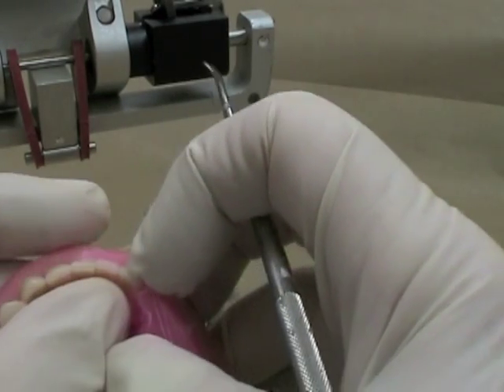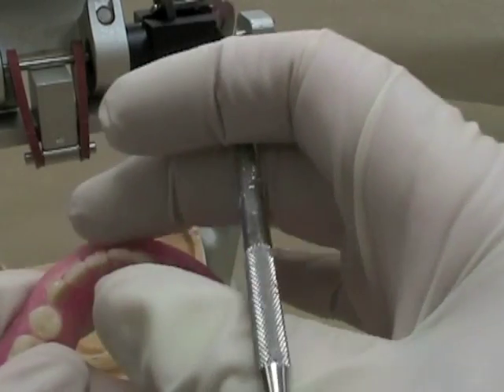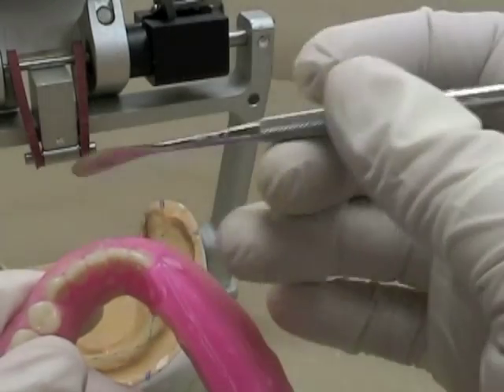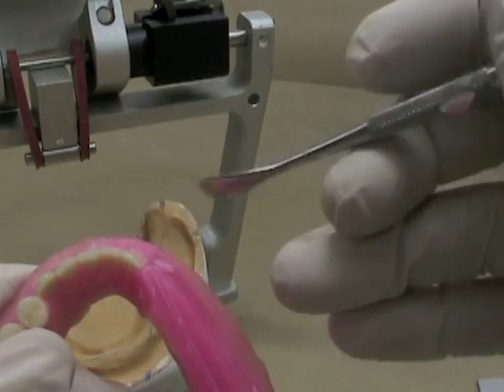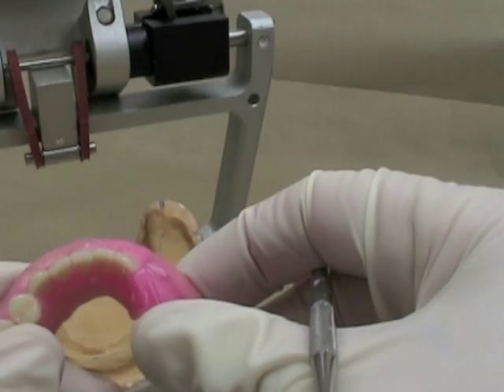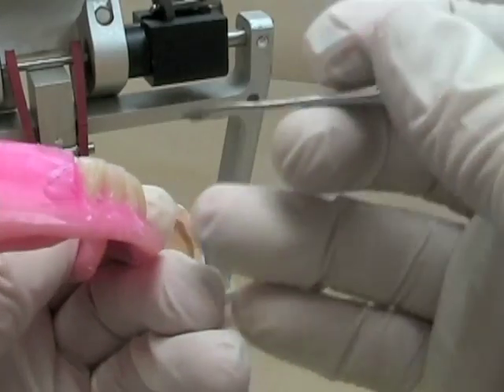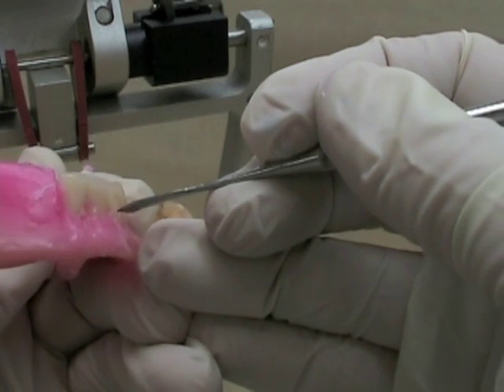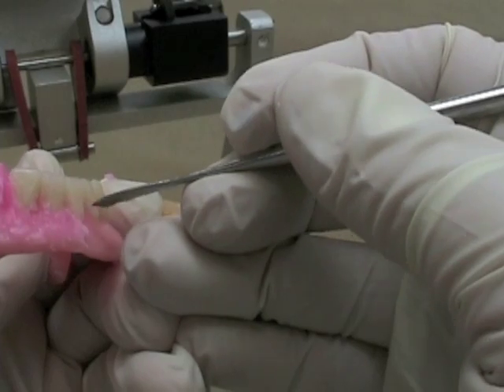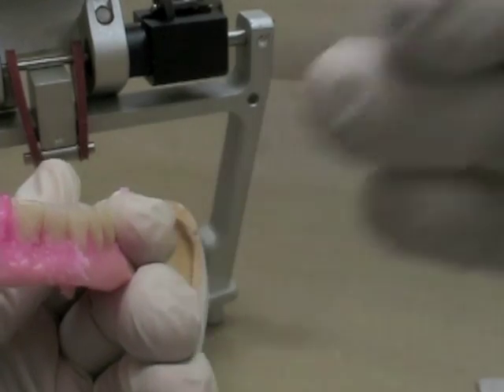Take a look at the prominence of the necks. Some of these may be a little bit more prominent. The ones I've set here are a little more straight up and down, or a little bit more proclined. These necks are looking like they're growing into the arch, and as we come around the arch you may see that these necks are starting to show a little bit prominent there. I may change those later.